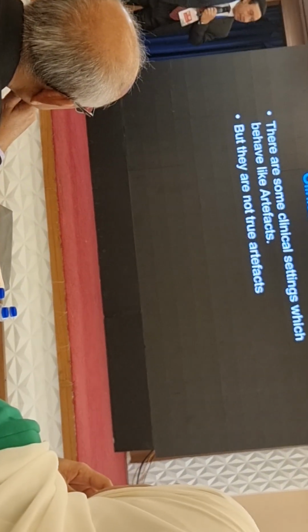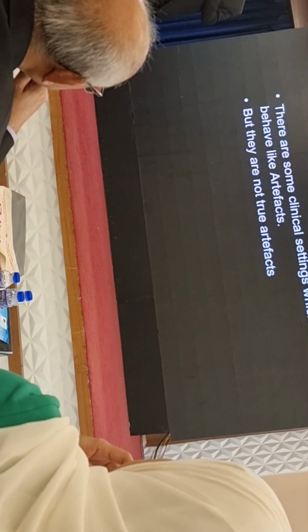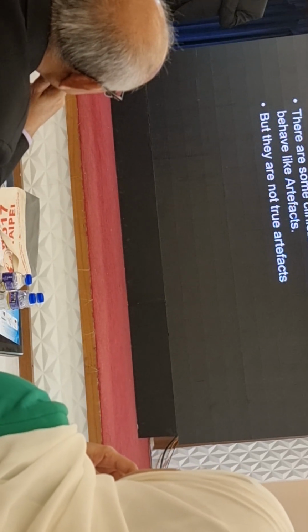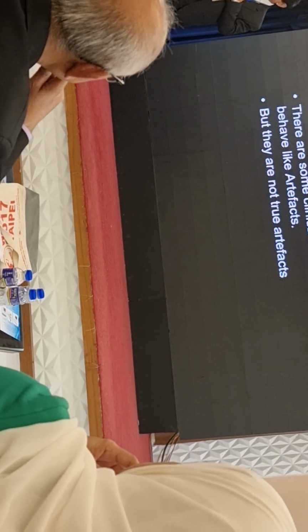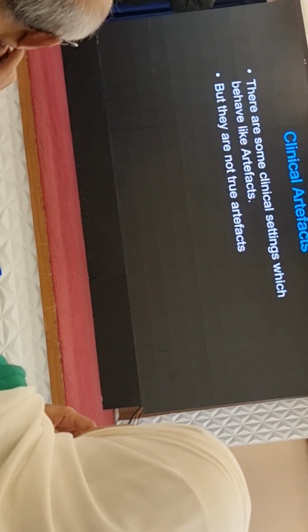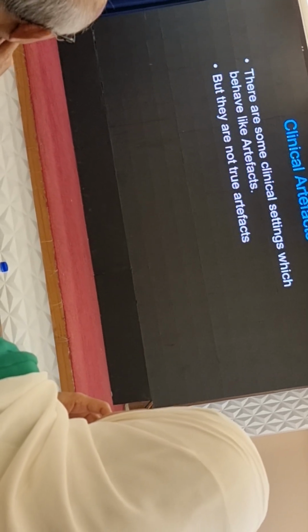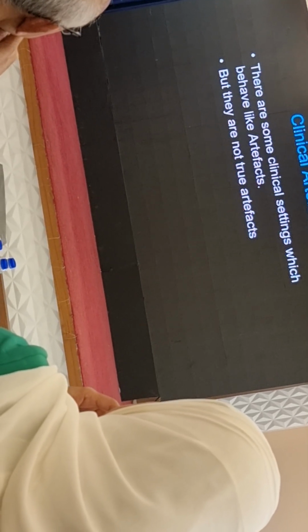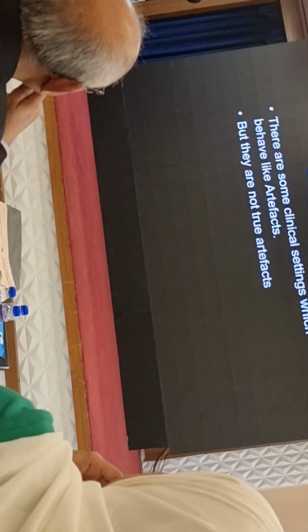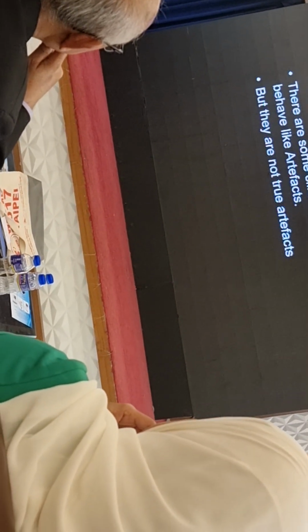Now, clinical artifacts. What is a clinical artifact? You will not get this term in any book except those written by me. But because I am not a very renowned author, this has not spread among other people. What is a clinical artifact? There are some clinical settings which behave like artifacts, but they are not true artifacts.